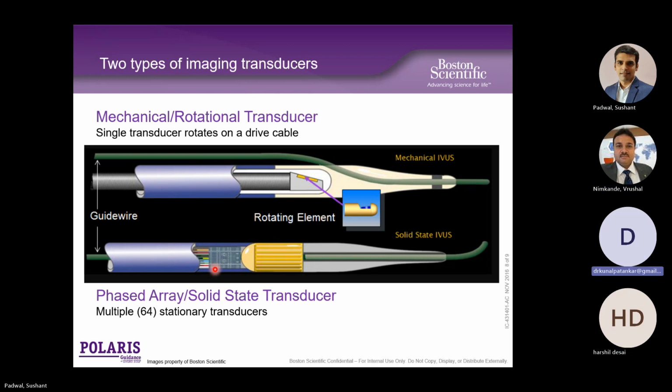Rushal sir, seeing the differences, it seems to me that solid state IVUS was the first IVUS ever made. And from there, all the inspiration has come into improving the solid state IVUS. Correct me if I'm wrong.